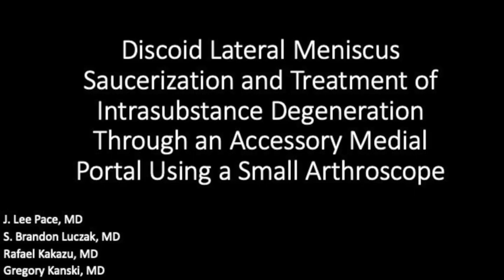Hello. In this video we will show our technique for discoid lateral meniscus saucerization and treatment of intrasubstance degeneration through an accessory medial portal using a small arthroscope.